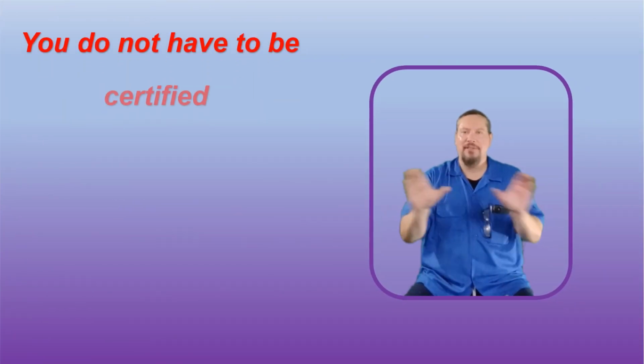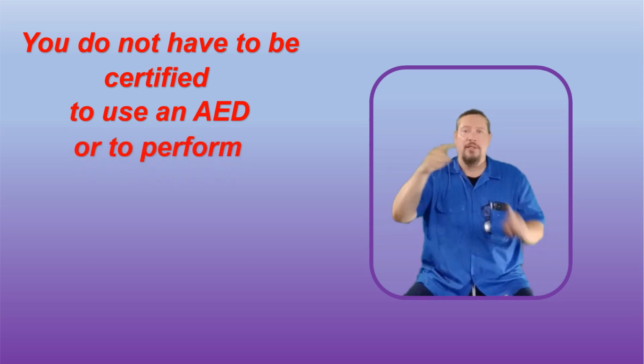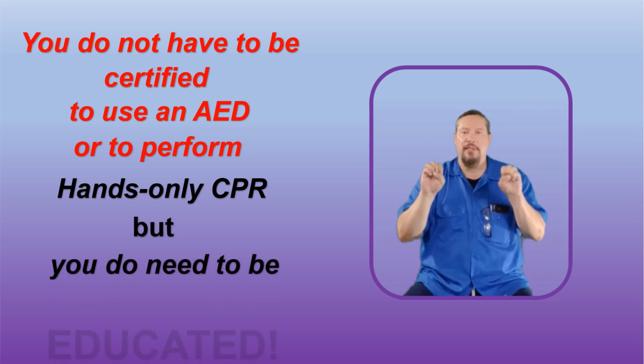You do not have to be certified to use an AED or to perform hands-only CPR, but you do need to be educated.